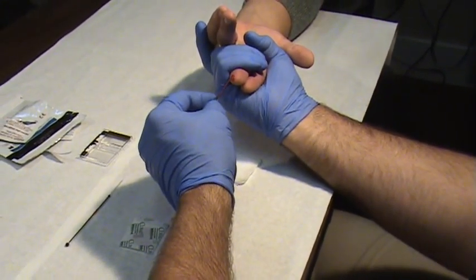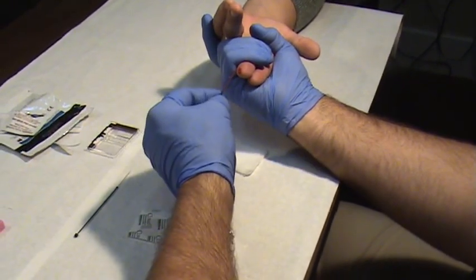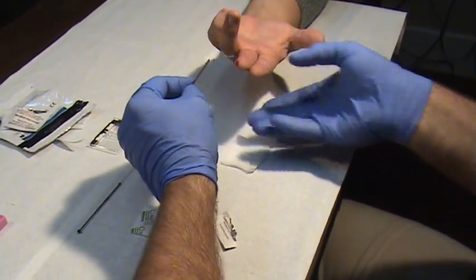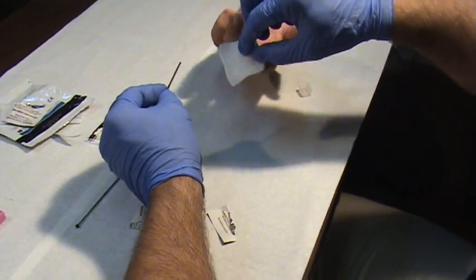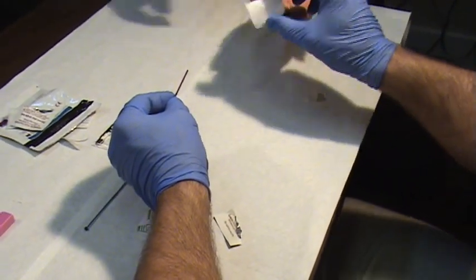So just have enough, have your plunger ready. You'll see that once I've got the blood, you apply the gauze, ask the patient to hold that on there.